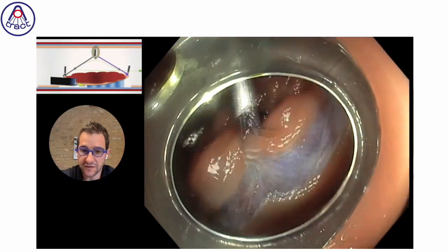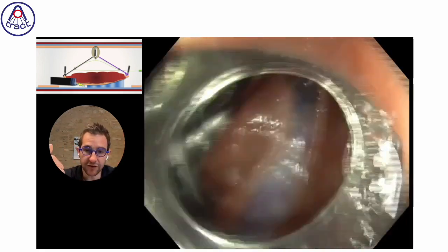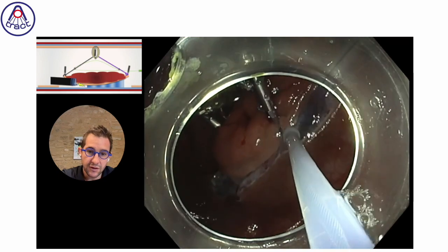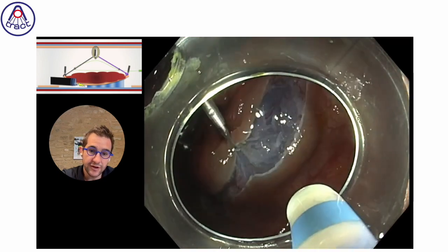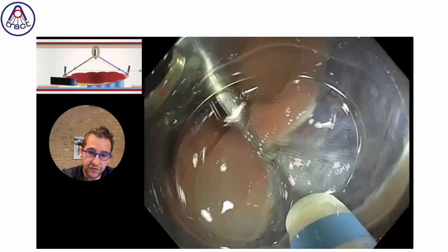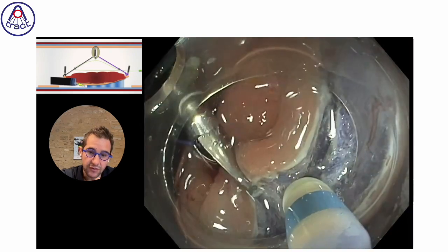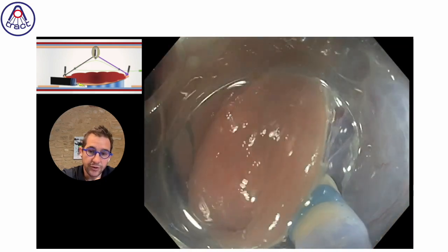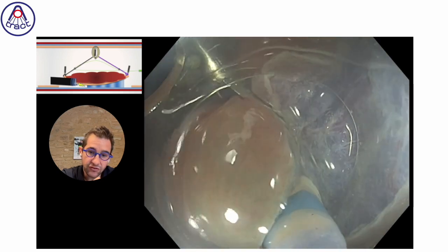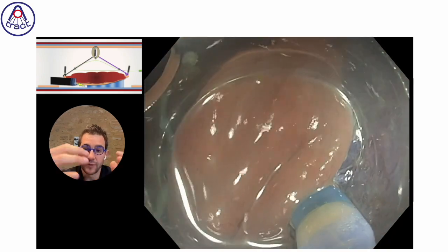And now you can see that the field of view is far better. It's opening the field, it's tracting all the fibers, and I re-inject only once, not really precisely because the field of view is very large, and therefore it's the beginning of the cutting and the dissection phase. But here you can see that the edge is really open and it's easy to cut a lot of fibers. And thanks to traction, you can feel it. The lesion wants to be removed.